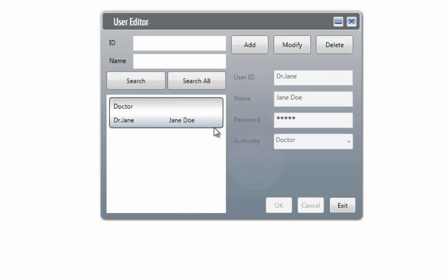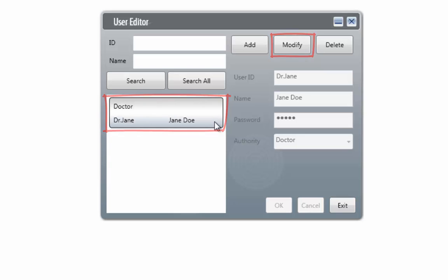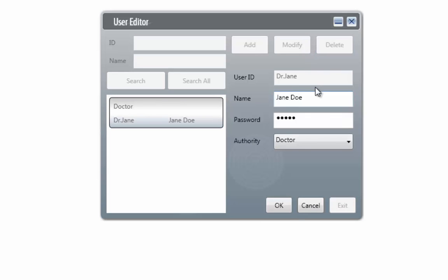If you would like to modify this account in any way, first select the account and click on the modify button. When you have completed your changes, click on the OK button.